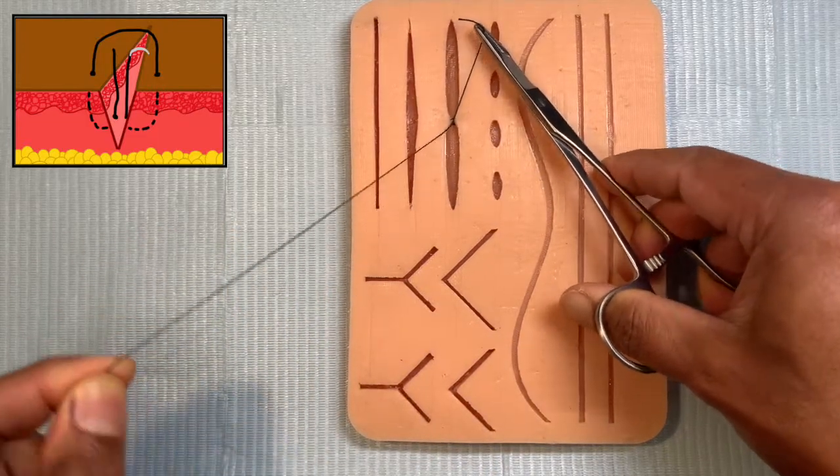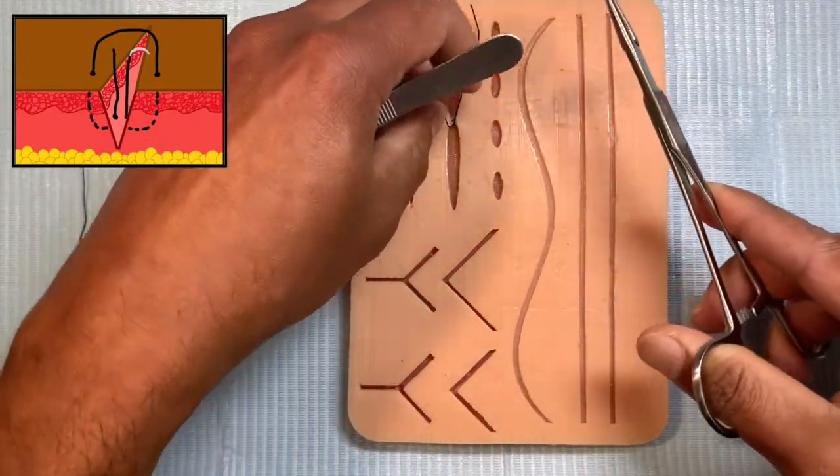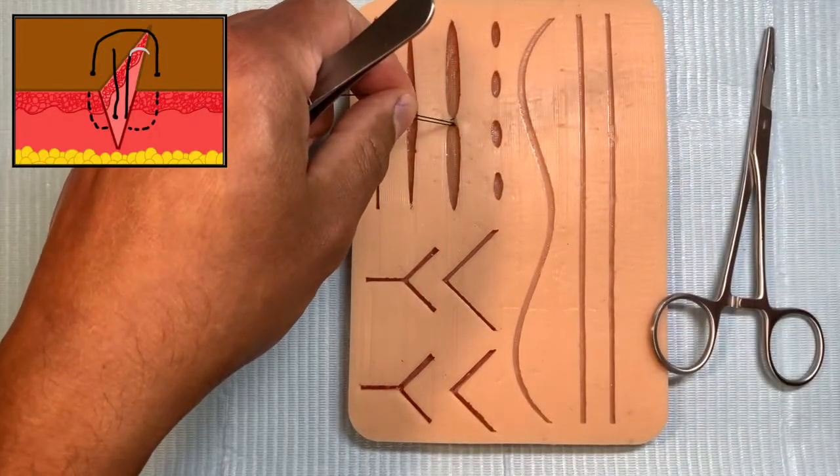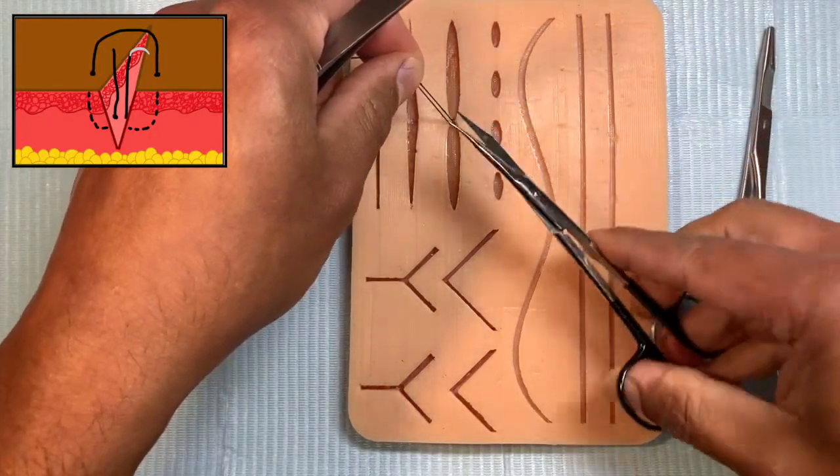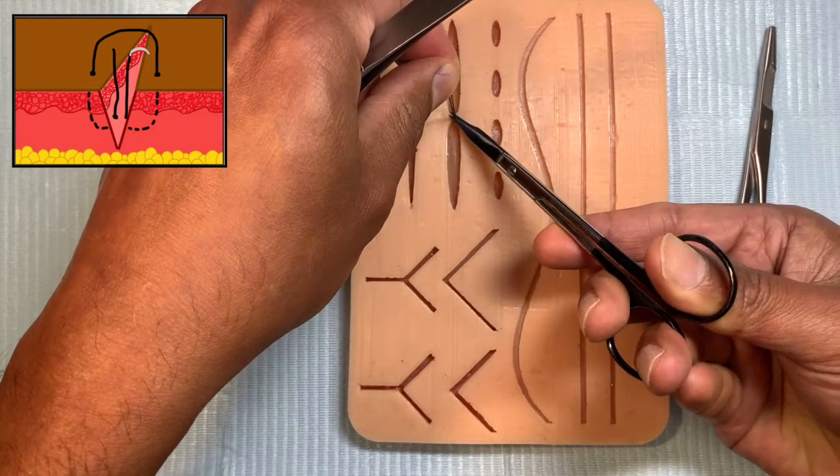So the result of all this is that you've got a knot which is sitting in the depth of the wound and not lying to the surface. And then you're going to cut this really short just above the knot and use a sharp pair of fine scissors like these scissors is good.